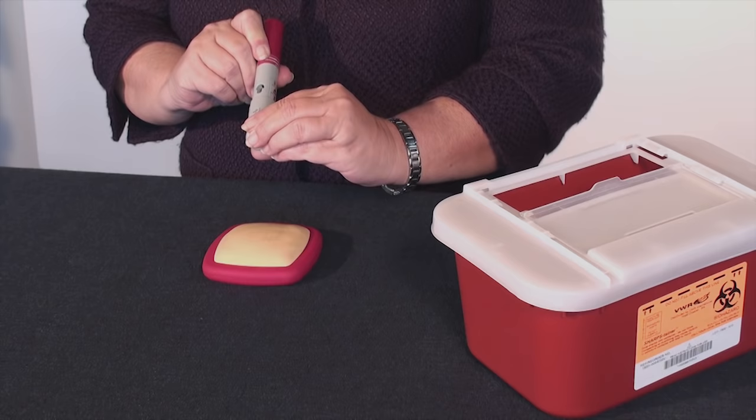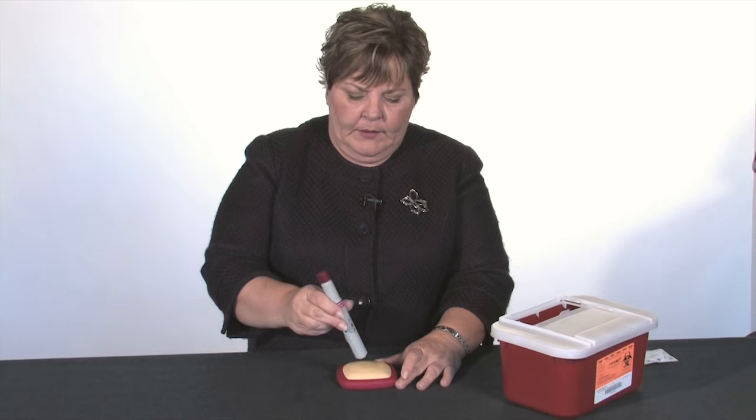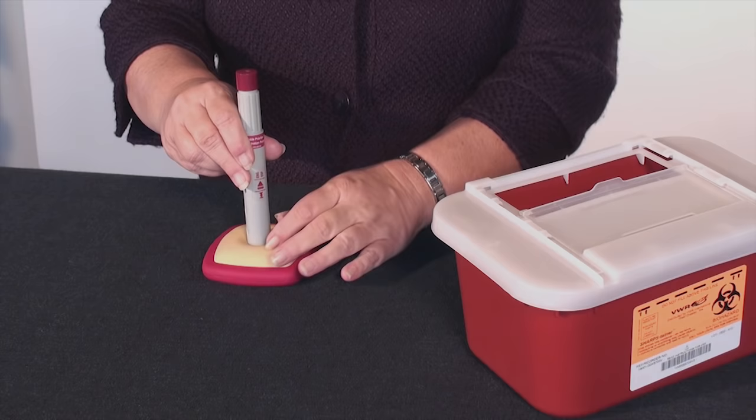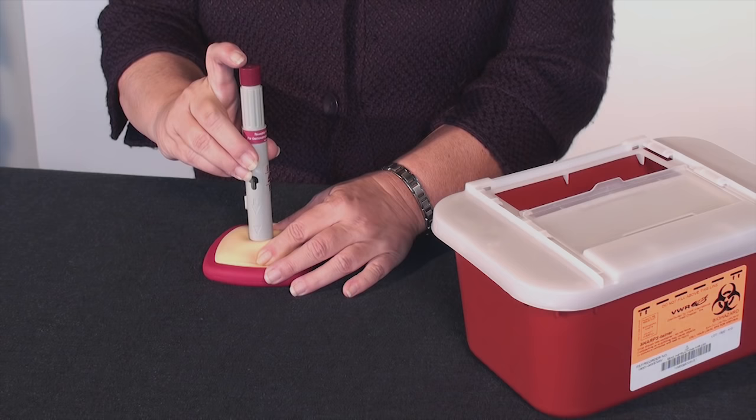First we remove cap one, then we remove cap two. We're going to hold this firmly against the skin. You do not want to come in at an angle, or chances are it will not fire. It needs to be firm and depressed flush all the way around. If you try to inject and nothing happens, pinch the skin to get a little bit more of a firm surface.